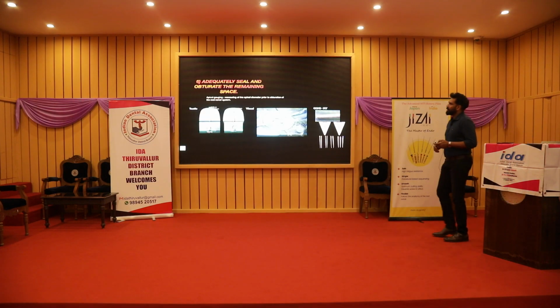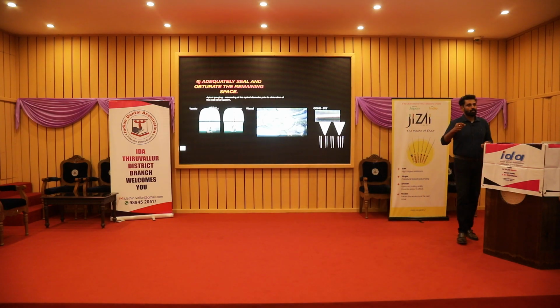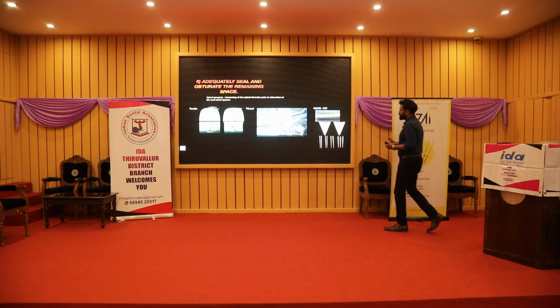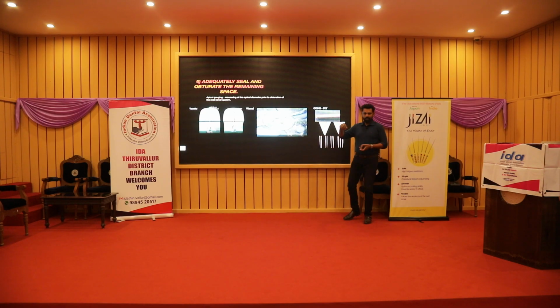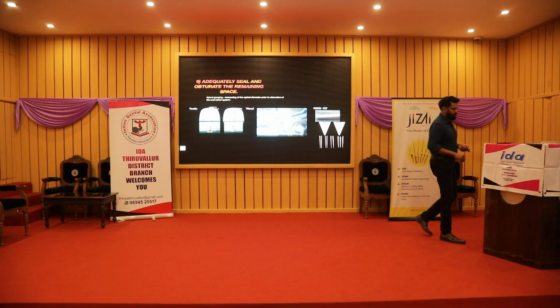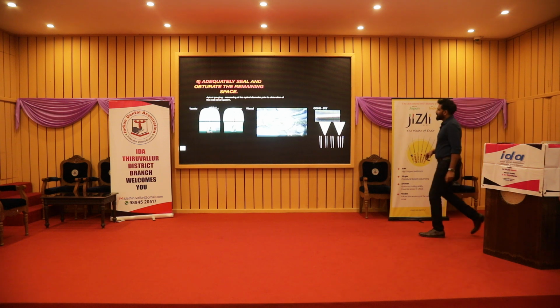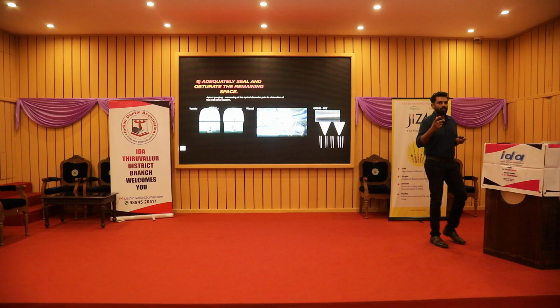And finally, you have to obturate. Before obturating, you have to do something called a master cone check. For the master cone check, normally you can use a GP, or you can also use a nickel titanium file. I use a GP, inserting it inside the canal to check the master cone. Sometimes there will be a scratch mark at the tip, sometimes at the middle portion, or sometimes in the coronal portion. What does it mean?